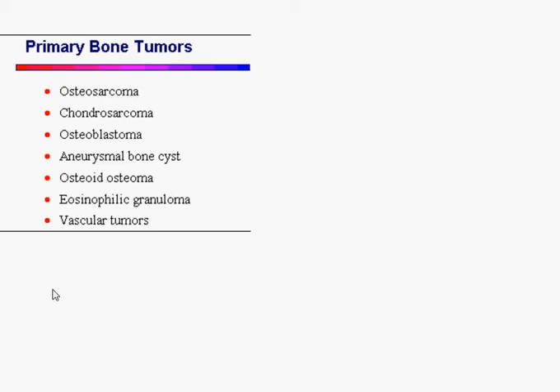Differential considerations would include osteosarcoma, chondrosarcoma, osteoblastoma, aneurysmal bone cyst, osteoid osteoma, eosinophilic granuloma, and vascular tumor. Correlating with the radiographs and CT examination, the diagnosis here was aneurysmal bone cyst.